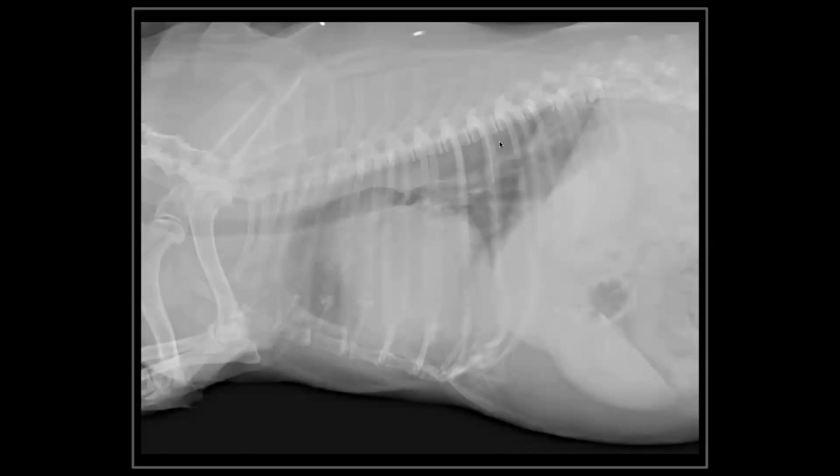This is made even worse by the fact that this patient is obese. Look at all the fat above, and look at all the fat here. So this patient is obese. It's an expiratory film, so it's a tough one to read. However, you would not be able to say that those lungs are normal, even though they have some potential artifact of an obese patient and an expiratory film with under-inflated lungs, but you cannot see those vessels, so you would have to call that positive.